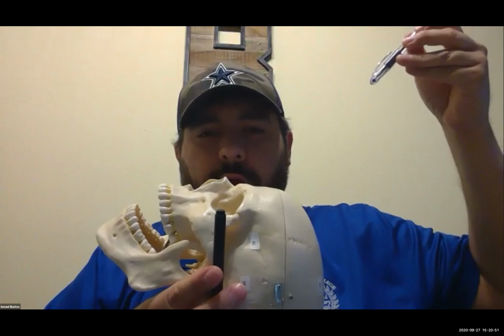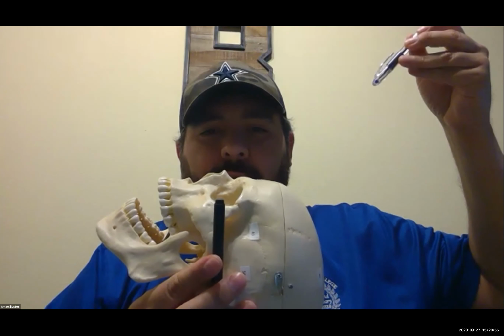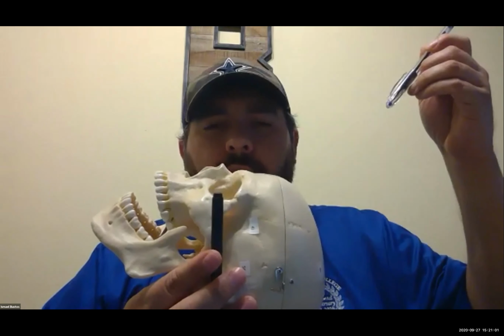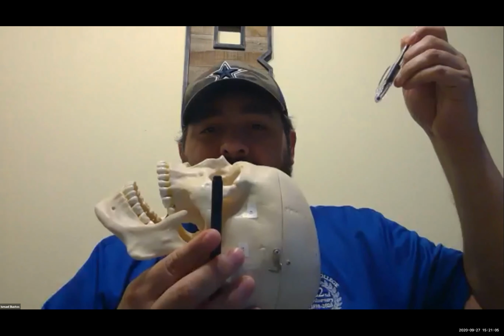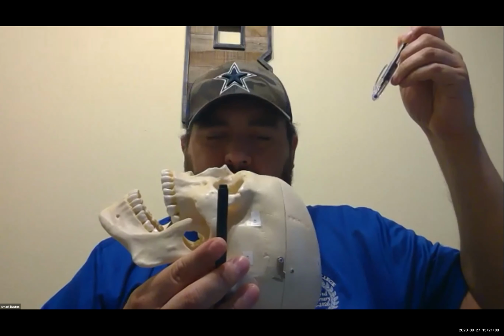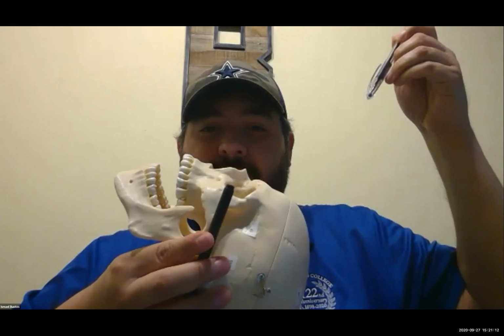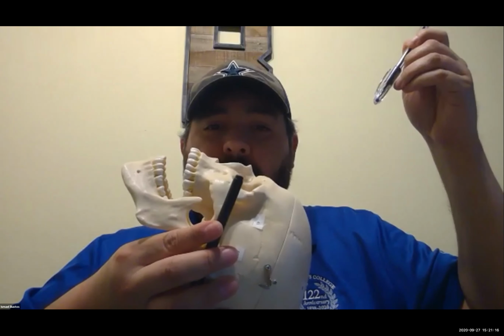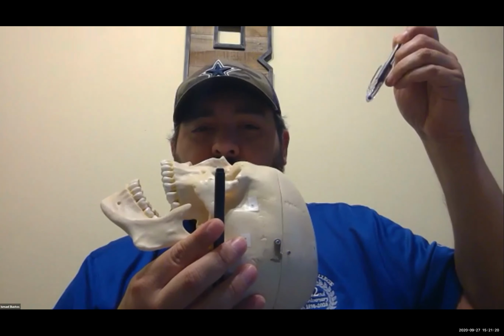caudal from the OML. Now remember, anytime you see the dorsum sellae projected superior to the foramen magnum or above the foramen magnum, that means that there was not enough angle between the CR and the OML, which is the black pin. Okay, so two things can happen: either I didn't angle enough, or what can cause that OML to come back towards the CR? If I extend the head too much, what happens? The distance between the OML and the CR has decreased the angle. If I need to, then I would need to flex the head more to bring that 30-degree angle between the CR and the OML.